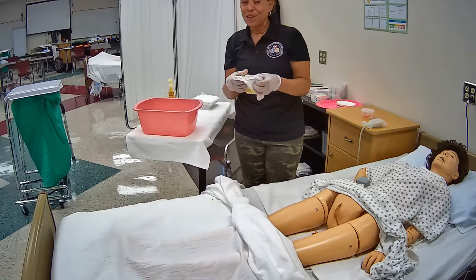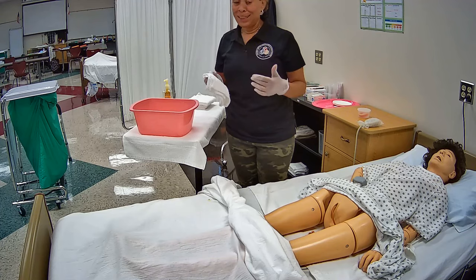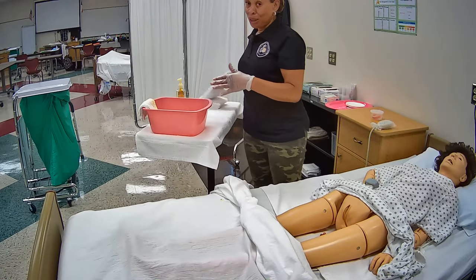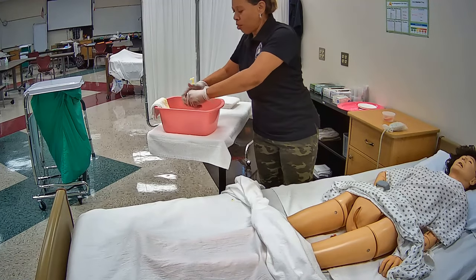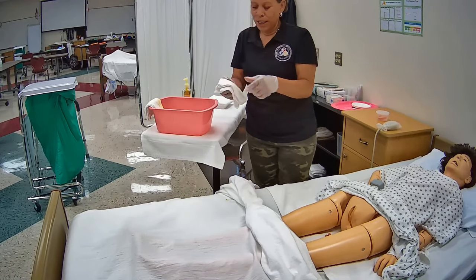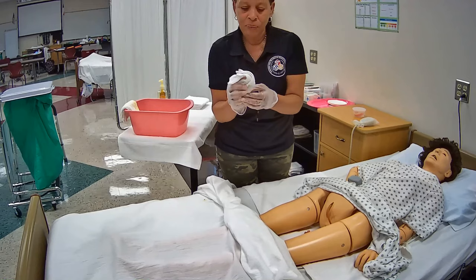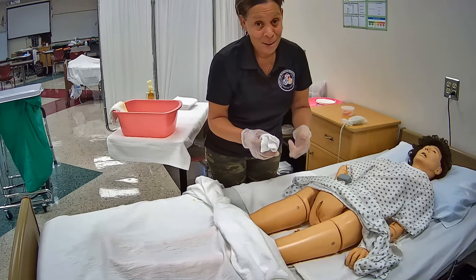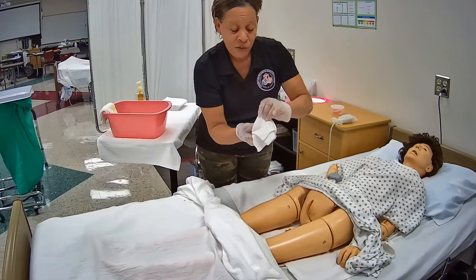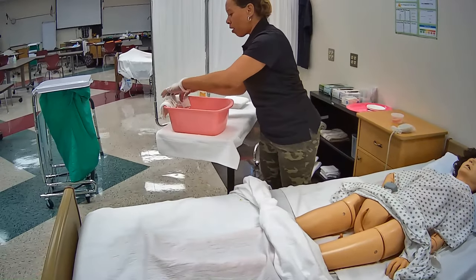You can actually use the same washcloth to clean the catheter, however I train my students to use a different washcloth because they're going to be nervous and I don't want them to forget to use a clean area. The second washcloth I'm going to wet but I am not going to put soap on it. I'll squeeze it out really good and fold it in my hand so no parts are dangling. Mrs. Jones, I'm just going to rinse your labia on the inside — rinsing the side furthest from me, then flipping and rinsing the side closest to me. I'm going to place this washcloth over the basin.